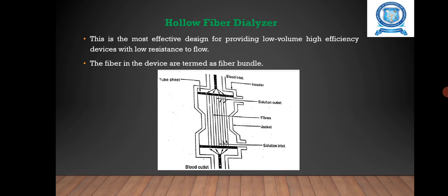Dialysis is the process by which waste products in the blood are removed and normal pH value of the blood is restored, obtained by an artificial kidney machine. It is also called diffusion. The process of water removal from the bloodstream is called ultrafiltration, and the amount of fluid removed is called ultrafiltrate. It is also known as convection. There are two types of dialysis method: hemodialysis and peritoneal cavity dialysis.